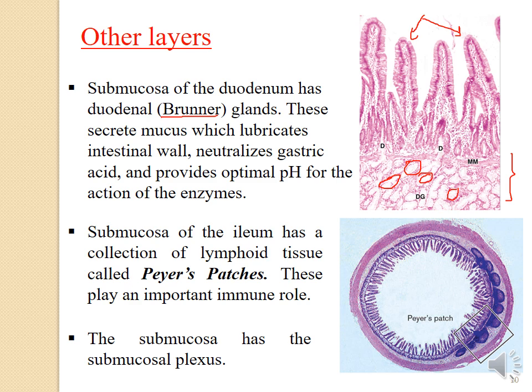So by the time food reaches the ileum, it is a hard substance, and therefore we require some protection. This is why we require mucus secretion in the ileum to lubricate the area and to protect the ileum from the hard food particles. This is why we have more goblet cells in the ileum. We are going to see a very similar situation in the large intestine.